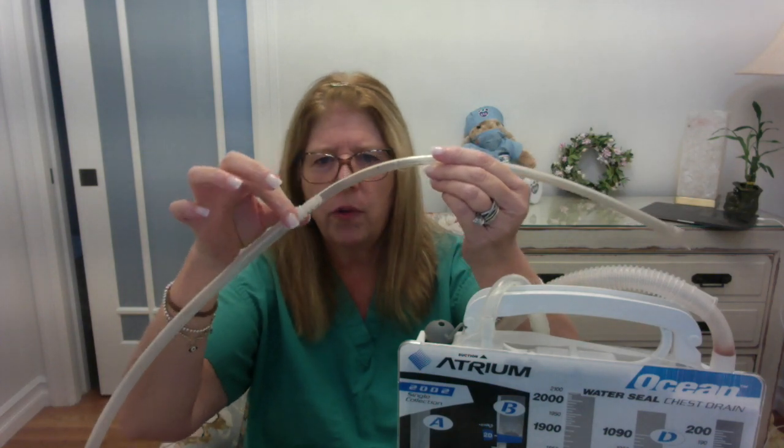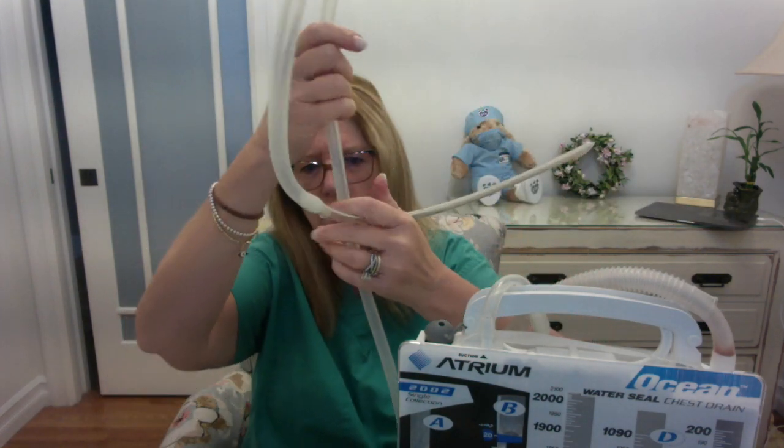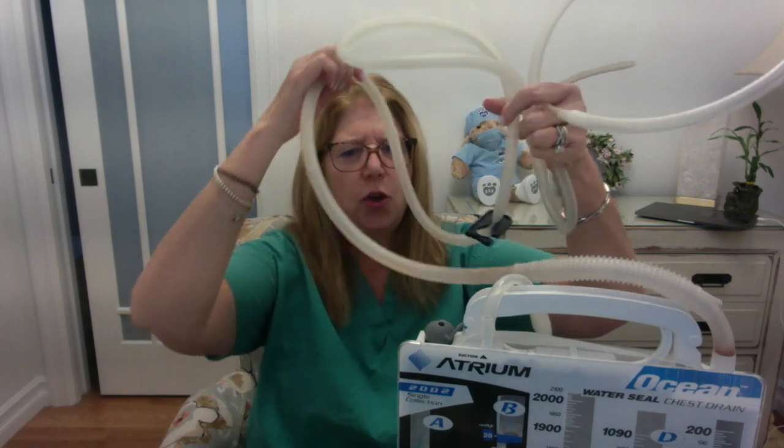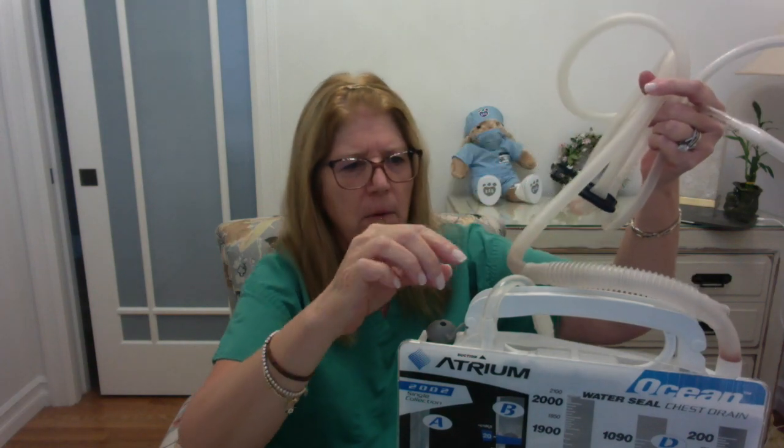These tubes are usually sutured in place at the level of the skin so that they do not move. Then we have a connection here. So this connection is going to tubing, okay, again, the tubing is long, that is going to be connected to our chest drainage unit. And you can see I have a little bit of drainage in there, all right? So this tubing is connected to the section of the chest drainage unit that collects all of the secretions that are coming out of the patient, right? Particularly those patients with a hemothorax, we expect to see drainage of blood and serous material into this chamber.